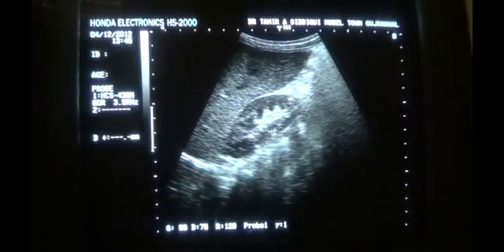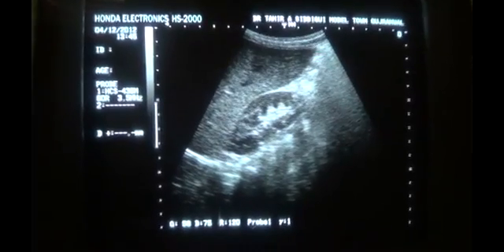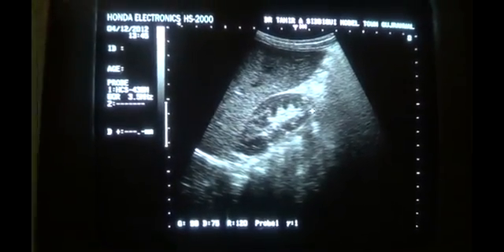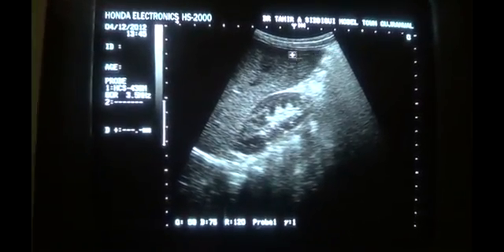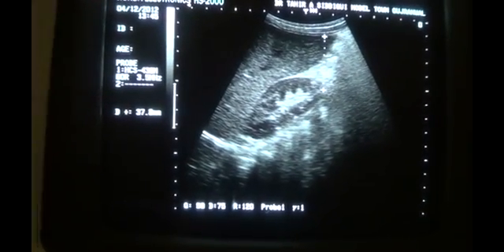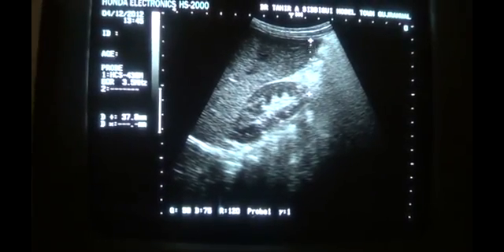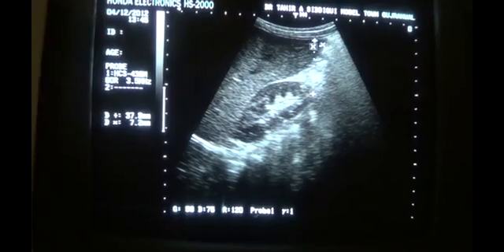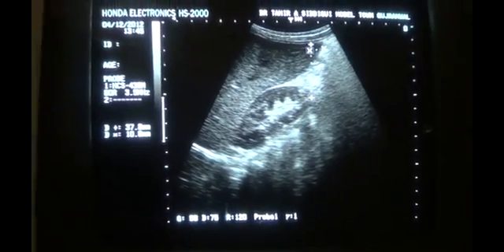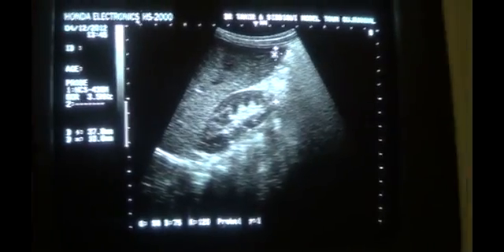By definition, we will say that because the liver is seen below costal margin, number one. Second, the liver exceeds the lower pole of the kidney, even a little bit, is suggestive of a liver that is enlarged minimal to moderately.